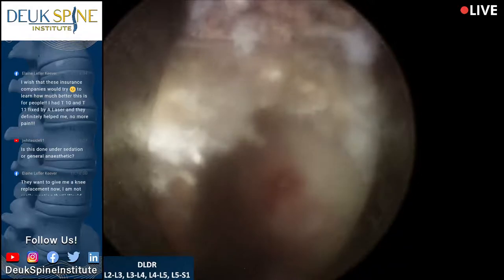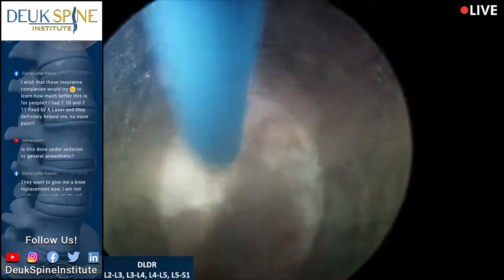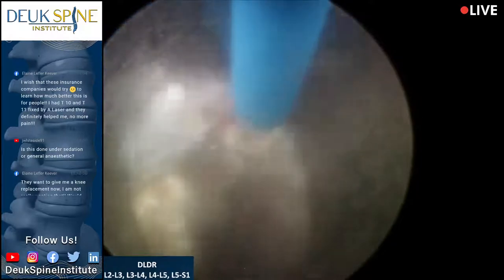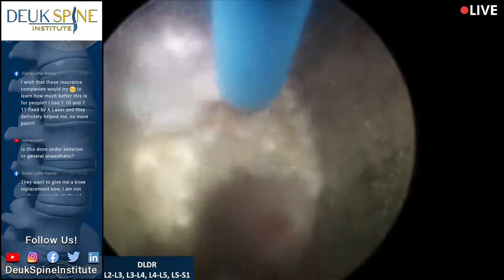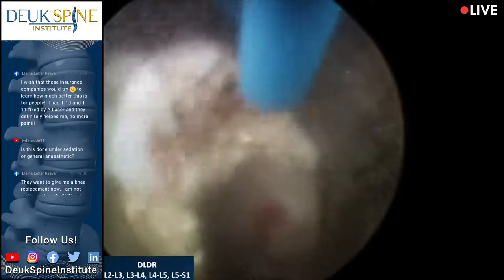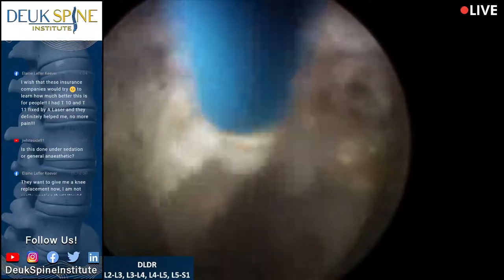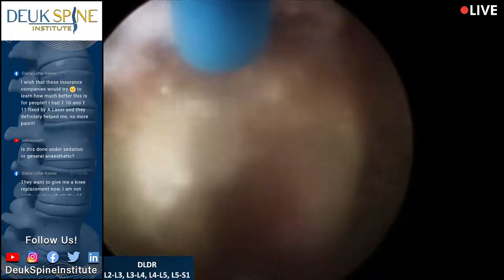I need 2 minutes and I'll be done. Just want to finish this last bit of annular debridement right here. You're doing great. You're going to be so happy when this is all done. It's calcified, by the way, in case you're wondering. 10 seconds. You're doing great. Just lay still.